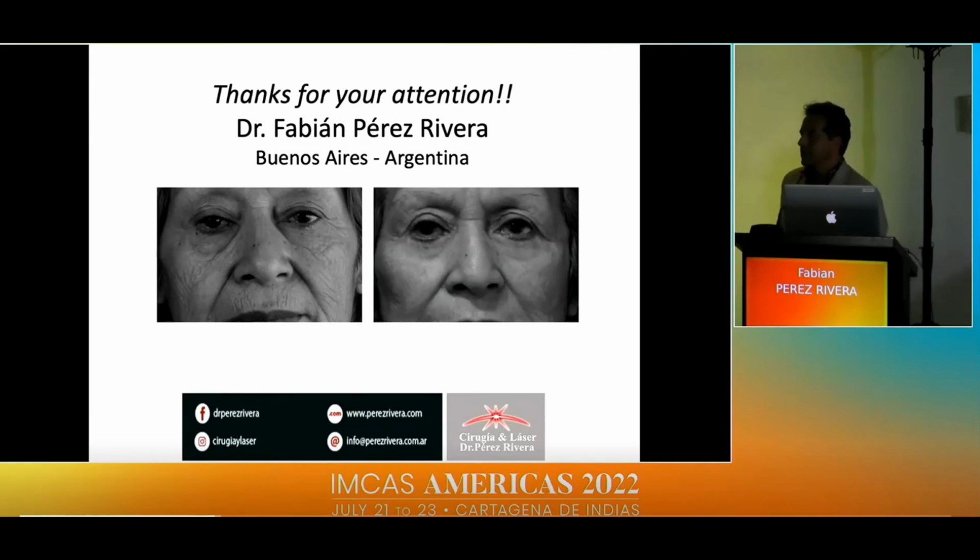I have a question. You say you don't do it in the OR. The laser is at the office. You never combine some CO2 laser or another device during the surgery? Do you have a specific reason for that? Really good question. First, because I am the owner of my devices and I try to keep them safe. I never move them from my office. I have a center with 4 laser rooms, and I'm happy to work in this way.